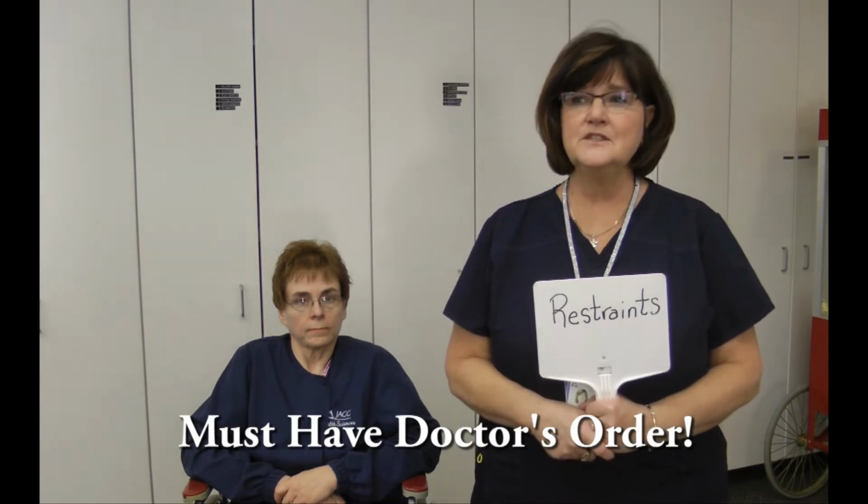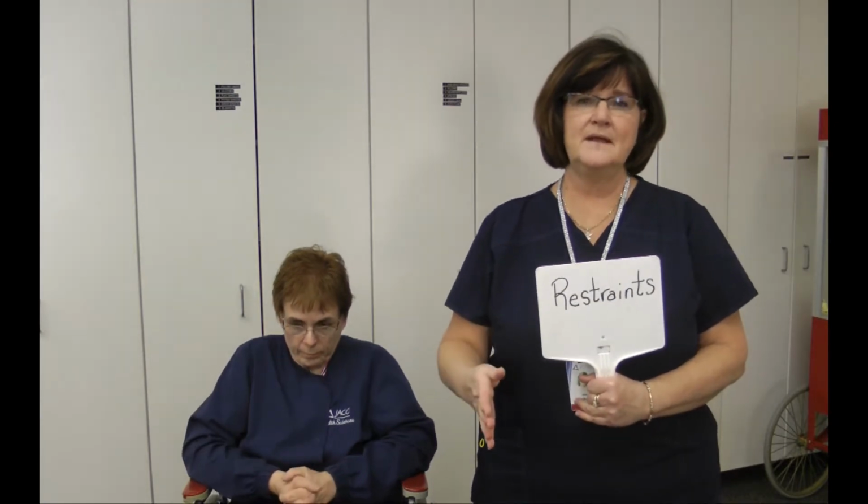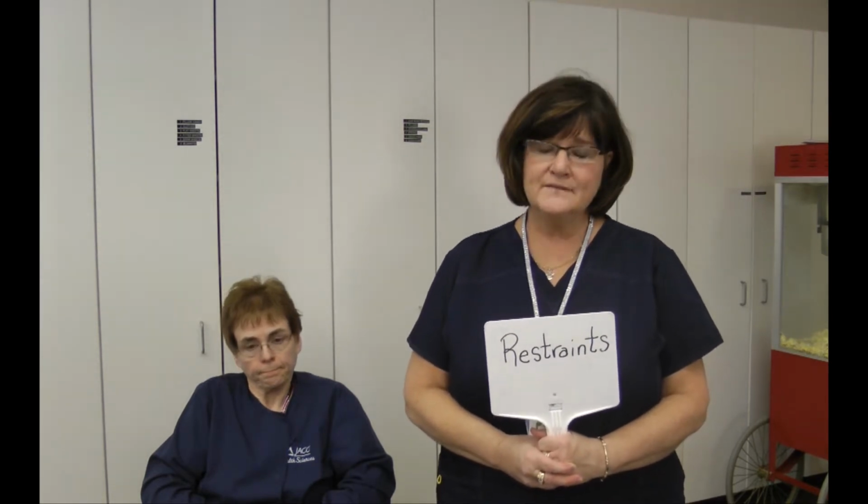Just for your knowledge base, I do want you to know that side rails are considered a restraint. If we put someone in bed and we put all four side rails up without a doctor's order or on the care plan, that can be considered a restraint because what we're doing is making that person stay in that bed. In the olden days, they used to put the side rails up and put a waist restraint on them, and these little people would try to climb over the side rails and sometimes strangulate their stomach area or what have you. So now, we have to have a doctor's order.